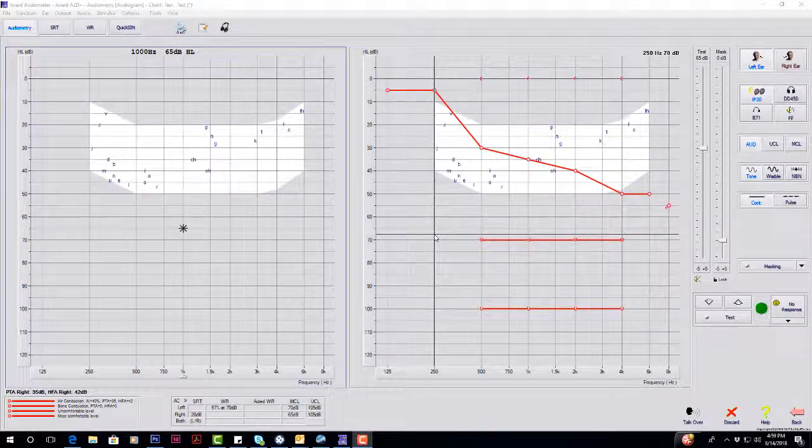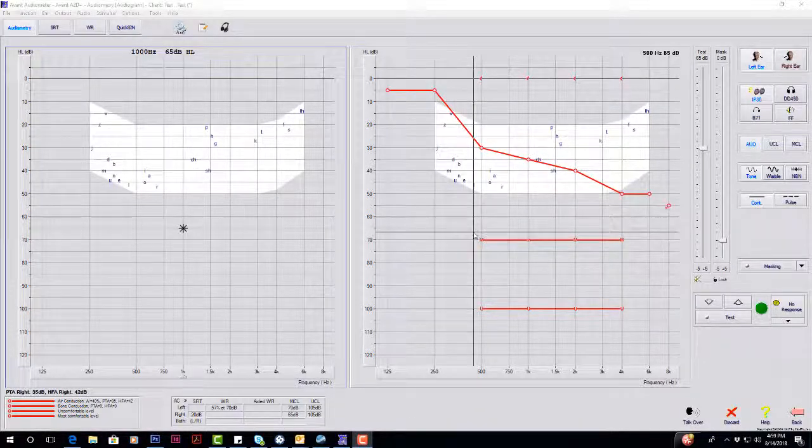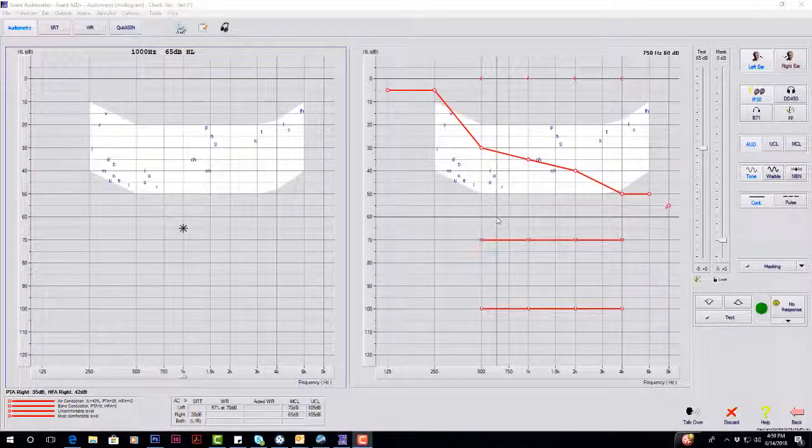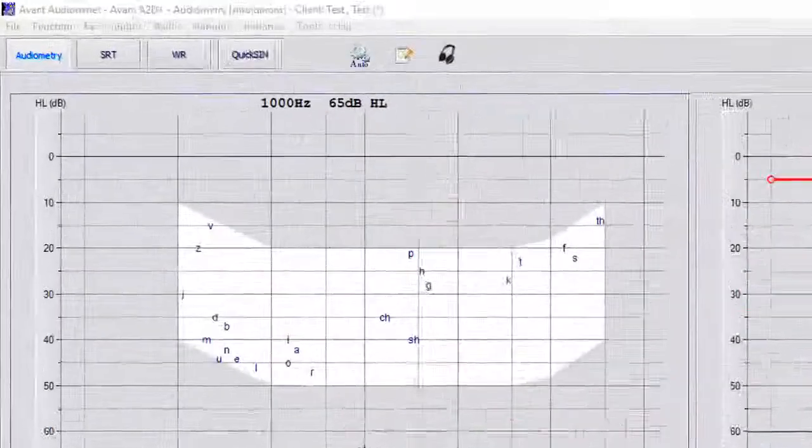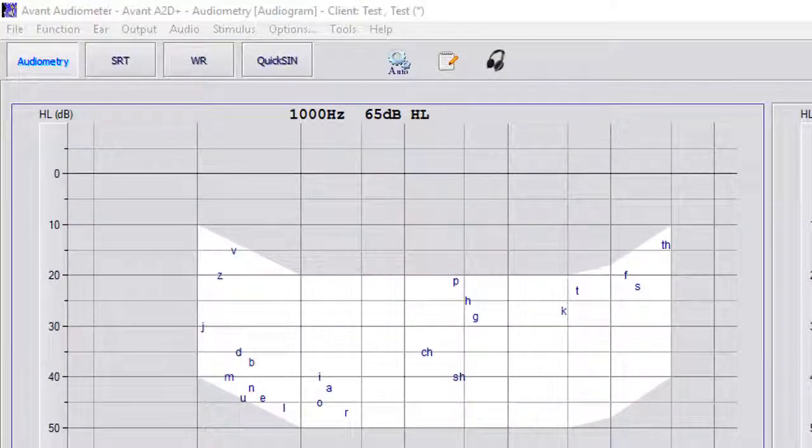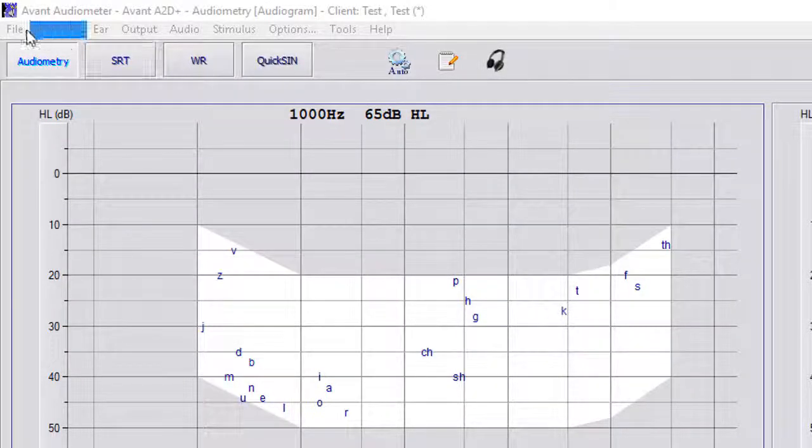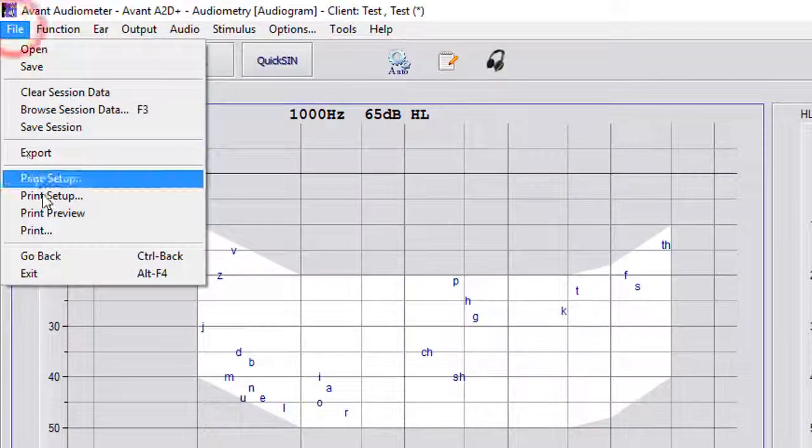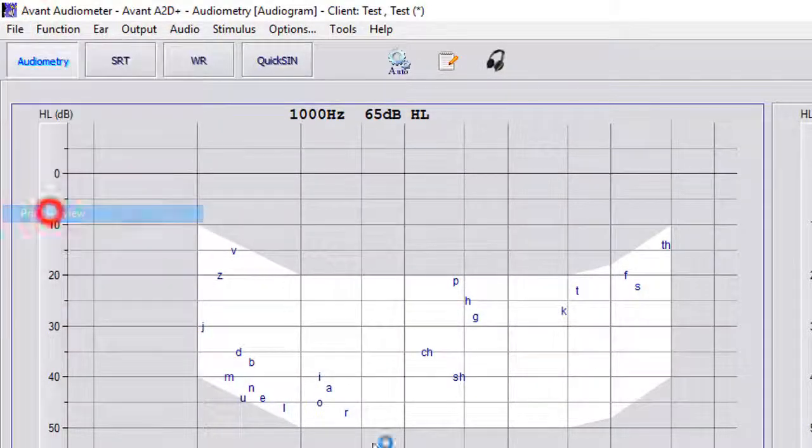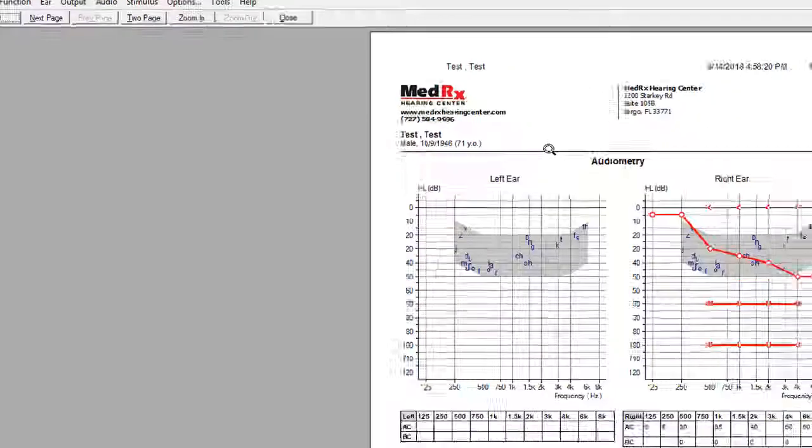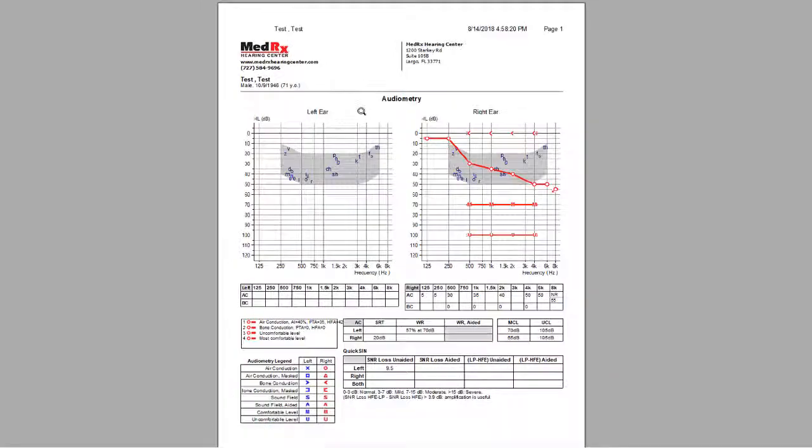Now that we have completed our test, we can go back to the main page here. And if we go to file print, we do have a custom printout here.